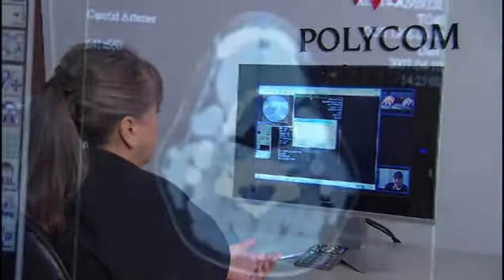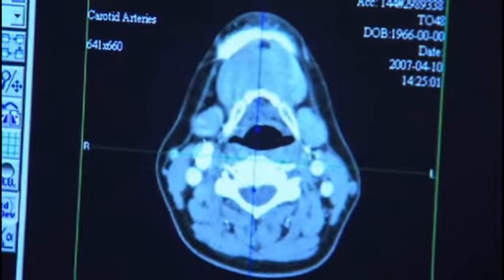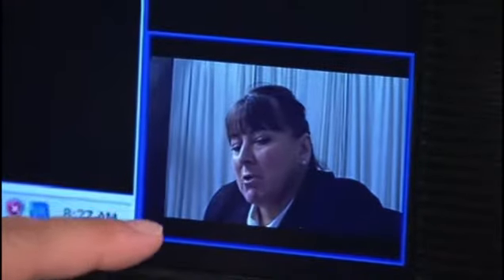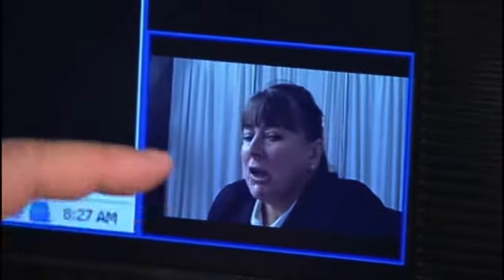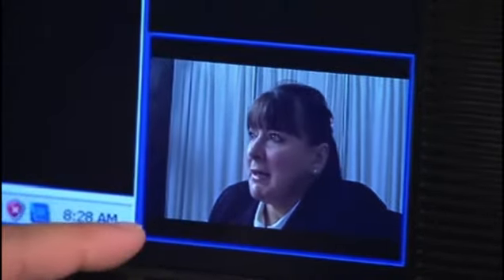Well, here we see an image of a CT, and this image is being sent from the Practitioner Cart. I can also see an image of myself, and this is important because you want to know what the patient is actually seeing to make sure that they're making a good connection with you.